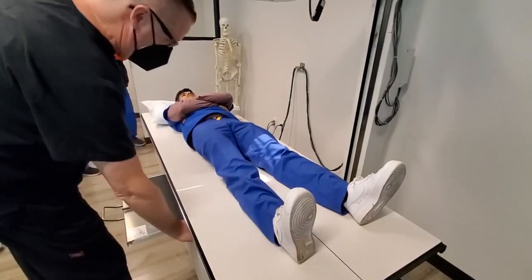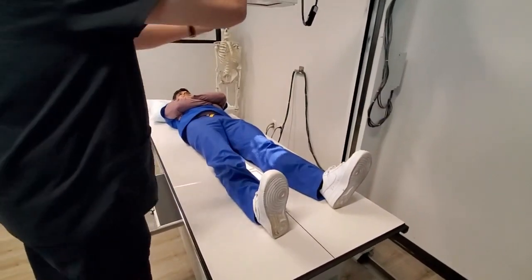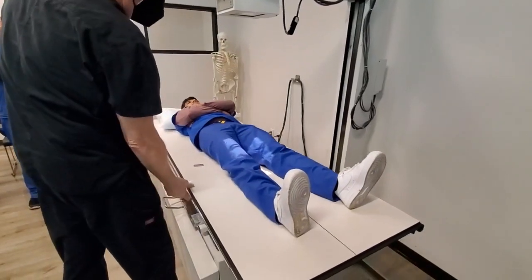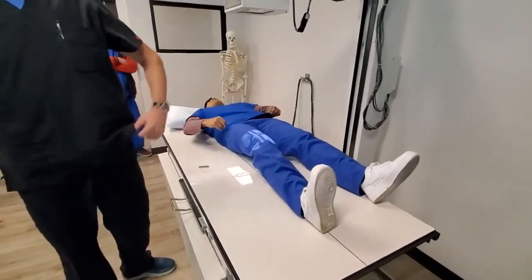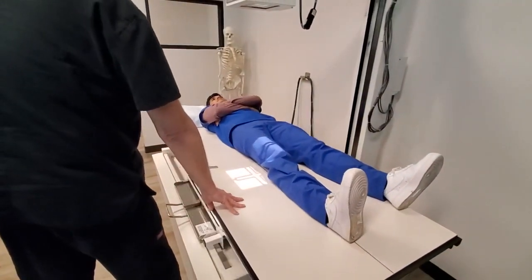So right now we want to be right on the knee — not mid-patella, but half an inch distal. We're doing the right one, so remember we can move the table to move the patient as well. Put it over to your left just a little bit. Ideally, when you have the patient lying on the table, whichever leg you're doing — left or right — try to get the affected leg right in the center line. That way you don't have to move the table all the way over.